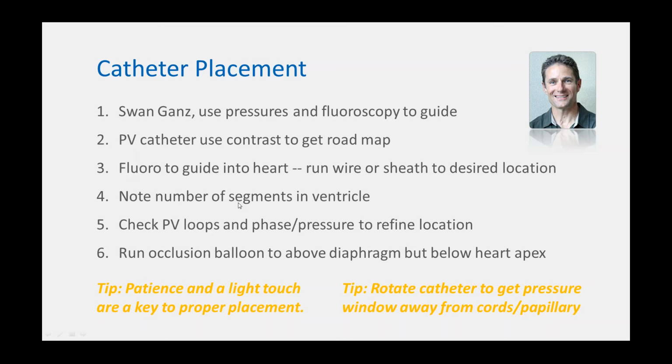We'll note the number of segments in the ventricle by fluoro, and that gives us a good starting place on our control box. Otherwise, you're forever fiddling around in your control box. Do we have 5 segments in, 4 segments, 6 segments? This will save a little bit of time during your experimentation.